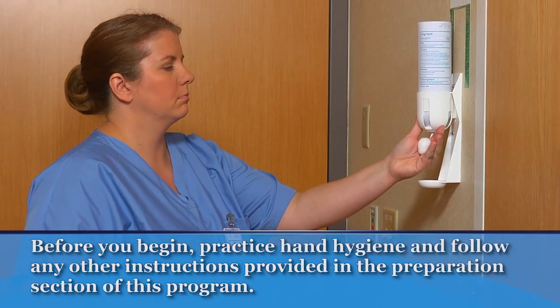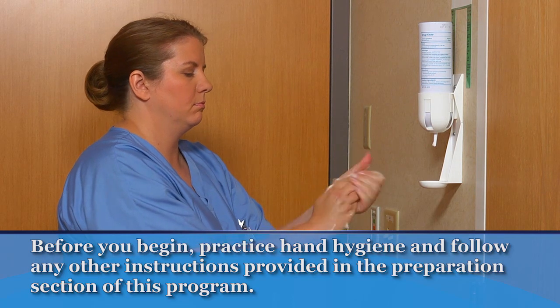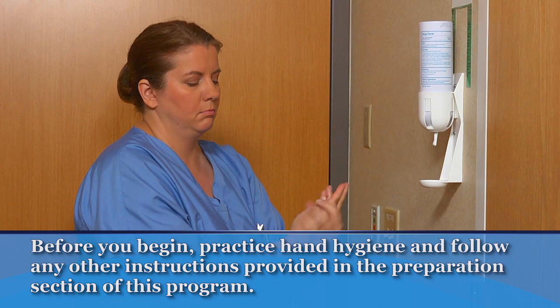Before you begin, practice hand hygiene. Identify the patient and make sure that privacy has been provided. Follow all additional instructions in the preparations section of this program.